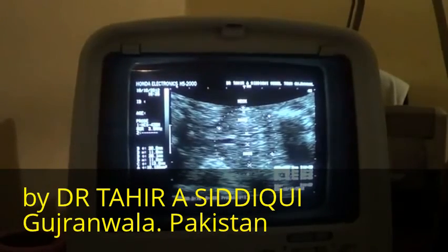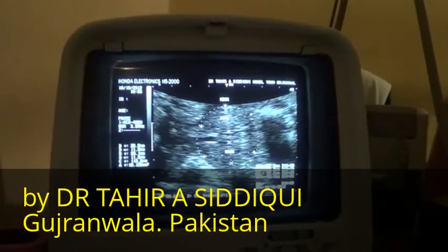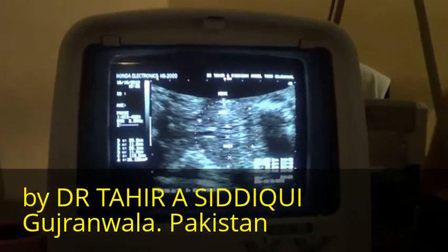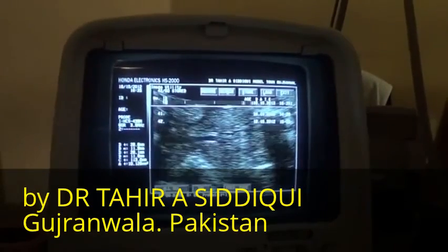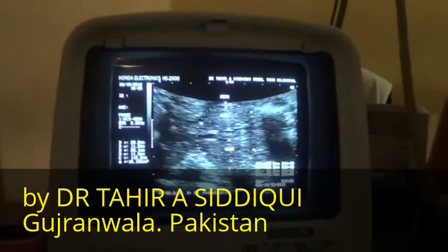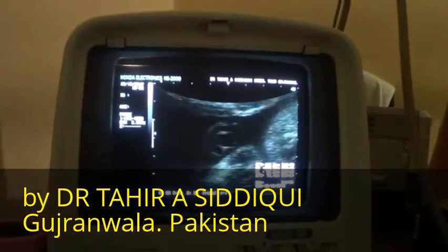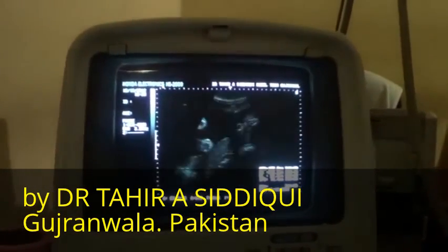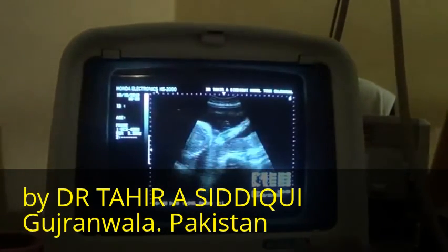There is no cystic area seen within it and it is well demarcated. And this is the reason for the fetal activity that we saw the patient was showing us, seeing the fetus to be much more active than expected normal.